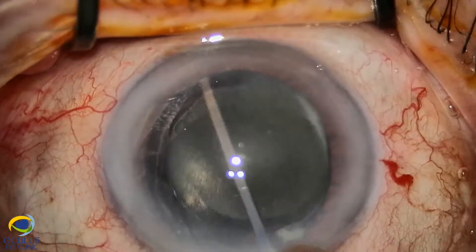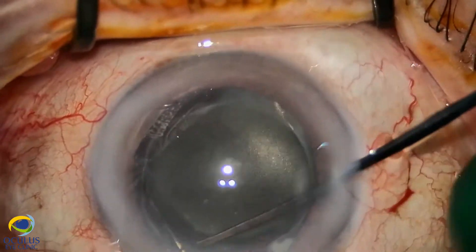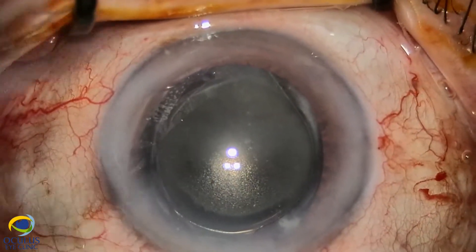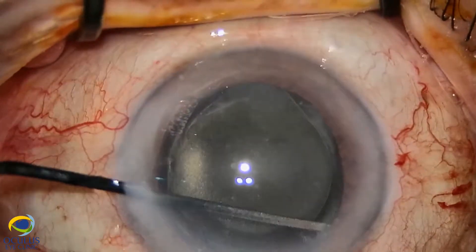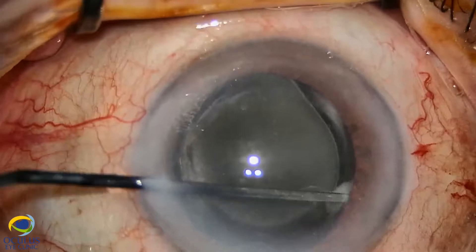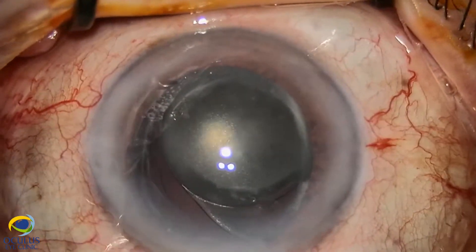First, under OVD we tried to gently detach the synechiae and the haptics behind the iris. We withdrew them from the space behind the iris and brought the IOL into the anterior chamber.